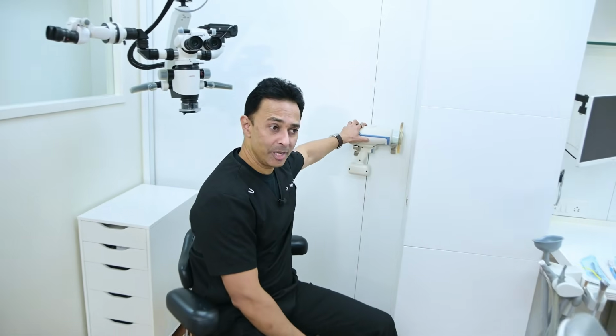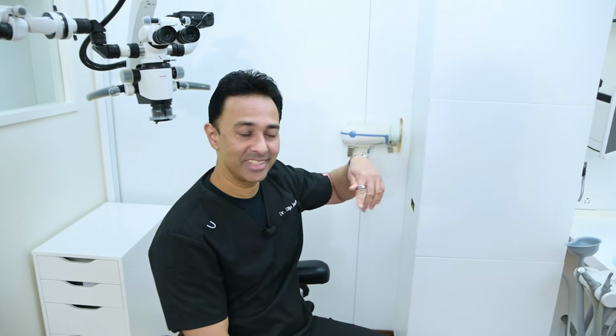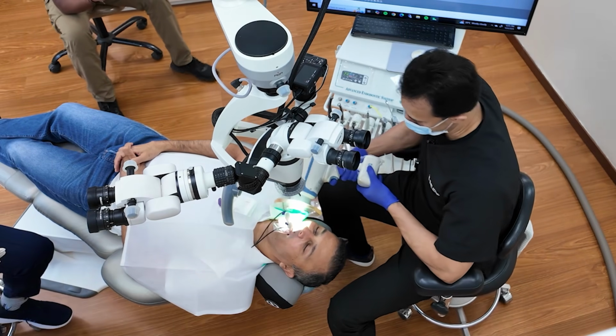The X-ray machine, very important because once you have a very large arm for the X-ray, that tends to clash with everything else. So a lot of those headaches are gone when we switch to a handheld X-ray machine. So we use that in the operatory.